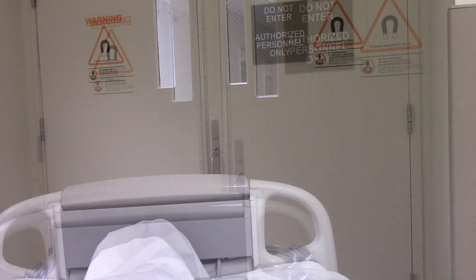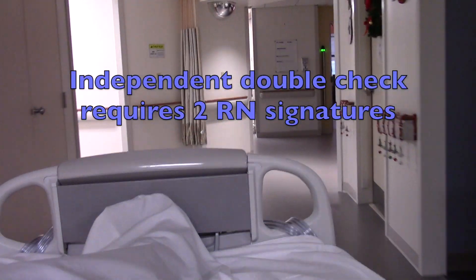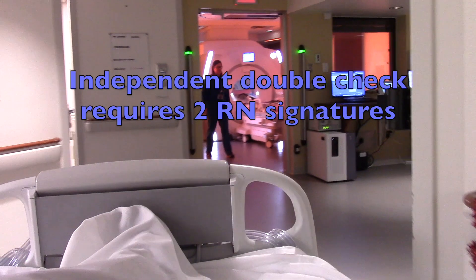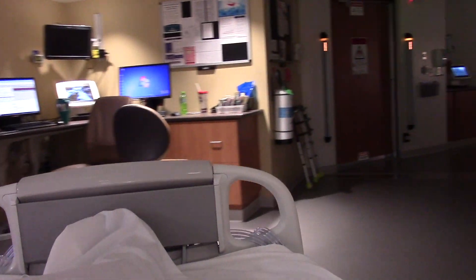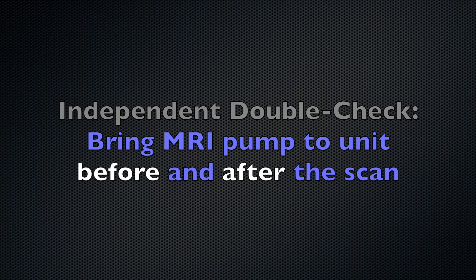Also, most if not all the medications that you will continue infusing during MRI are high alert medications and require an independent double check. Two RNs are required. To complete the independent double check, either two RNs travel to MRI and complete an independent double check before and after the MRI, or retrieve the MRI pump from radiology and complete the independent double check on the unit.